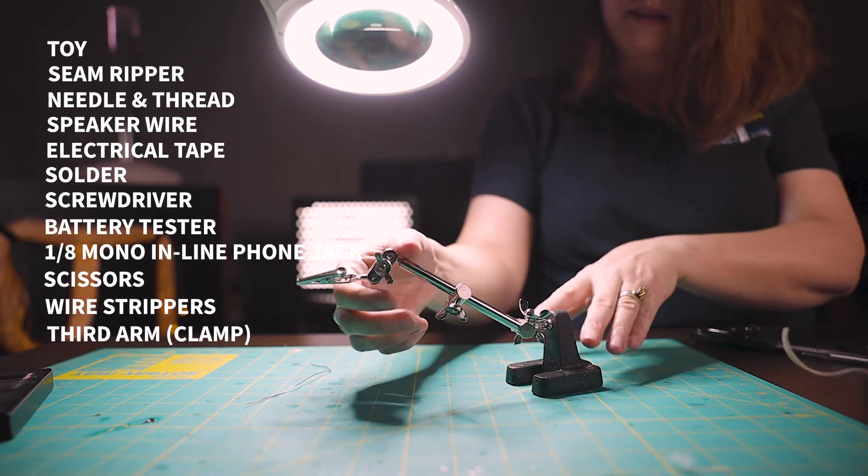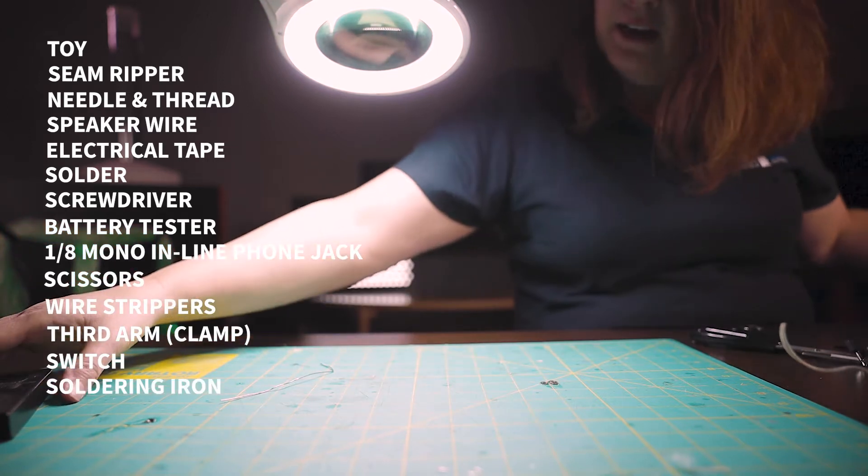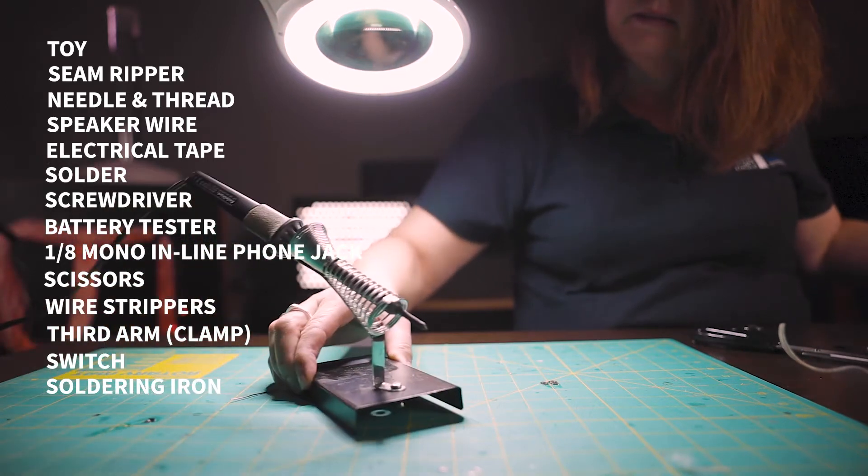This is a third arm — it's a clamp — along with a switch and a soldering iron with a stand.